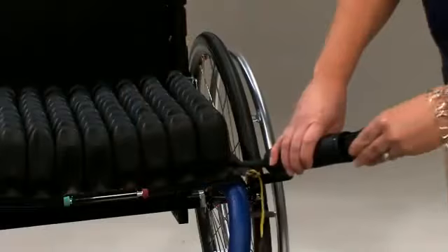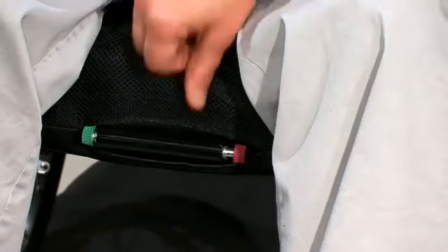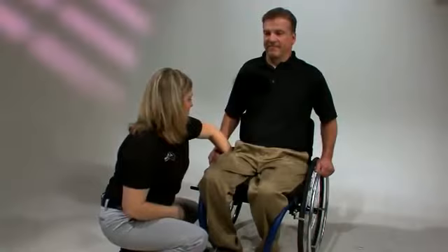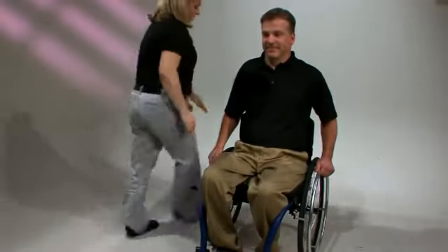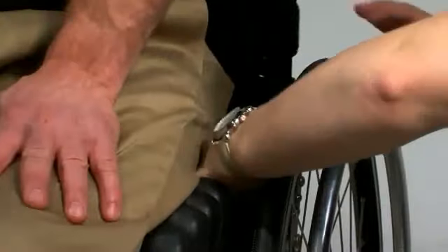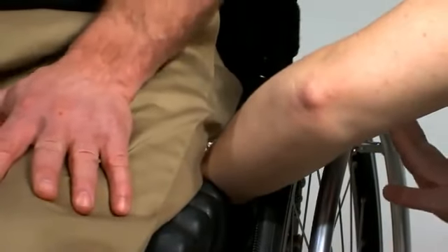Finally, if an individual has a fixed pelvic deformity, follow the steps for proper inflation. In order to capture the pelvic deformity, you must lock the isoflow by pushing the red knob to the left. This allows the cushion to adapt to a variety of pelvic positions. Always follow up with a hand check under the lowest bony prominence to ensure you have maintained at least half an inch (1.5 centimeters) of surface space between the individual and the bottom of the cushion.